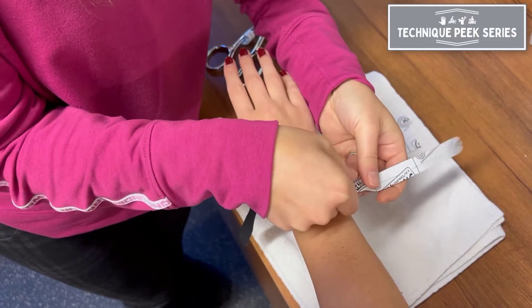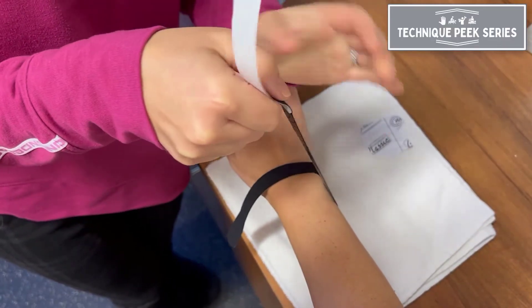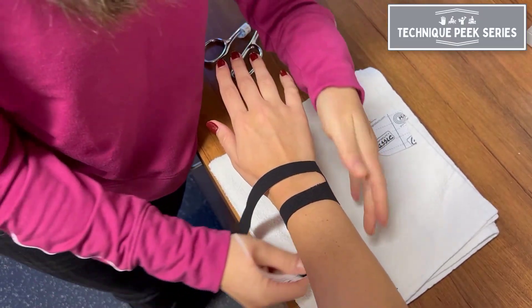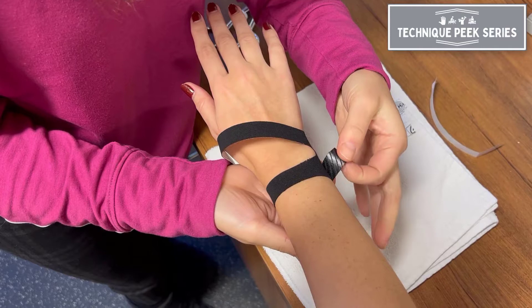Remove the tape from each tail almost all the way, about an inch from the end. Then apply 30% tension as you wrap around the wrist, finishing with no tension at the end of each tail.